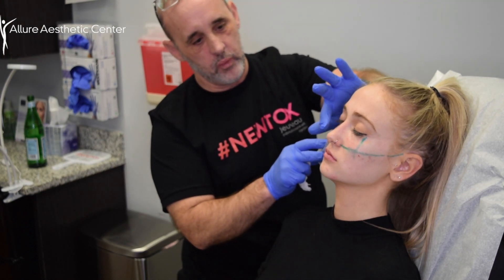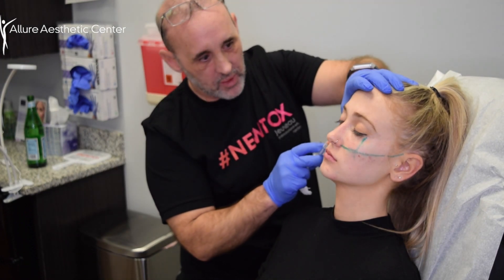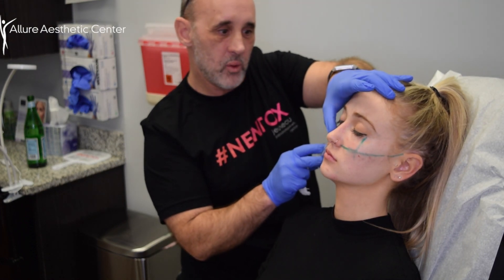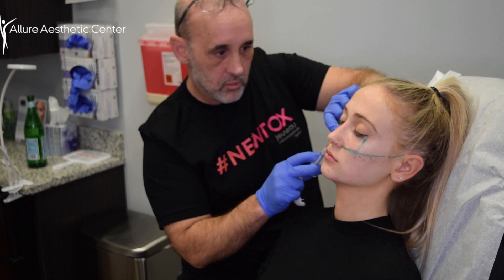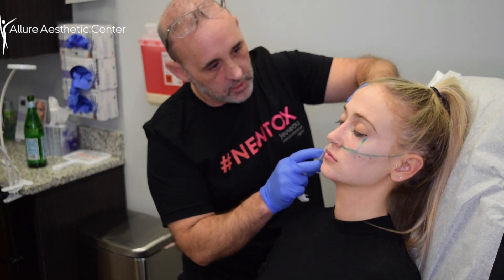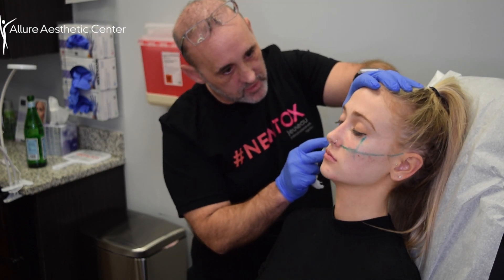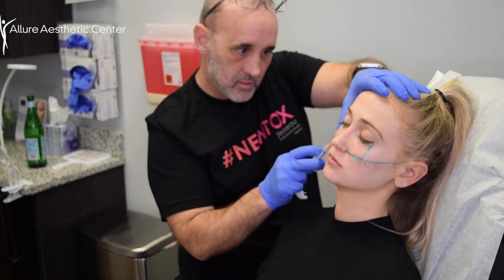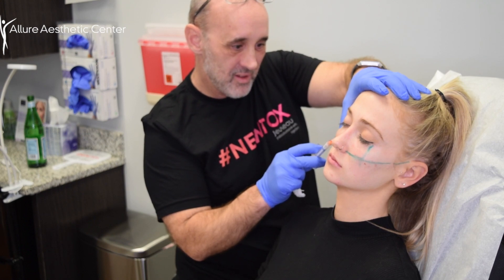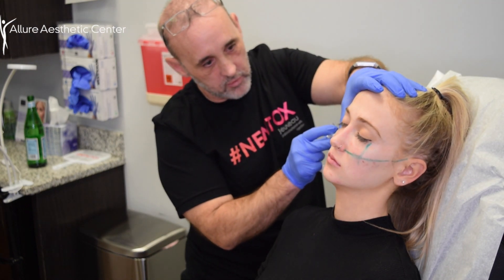Basically I'm just laying down layers of filler — I'm not squeezing in a whole lot all at once. I want it to look natural, I want it to look like a normal natural cheek and not like it's balling way out looking all crazy. You just want to replace just what has been lost and not overfill, because when you overfill a cheek I don't think it looks good. What do you think, Brittany? I like natural.